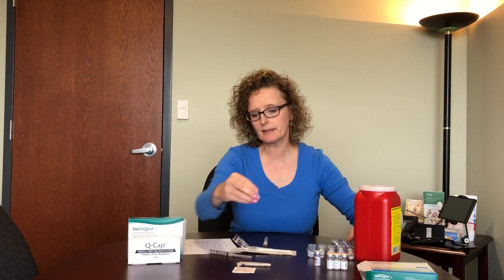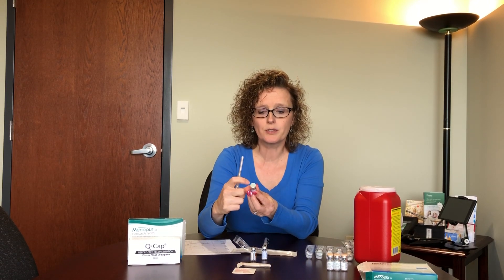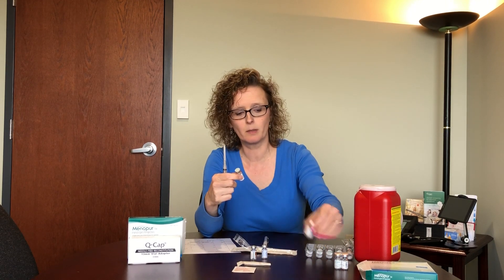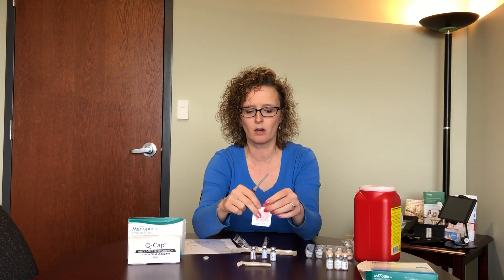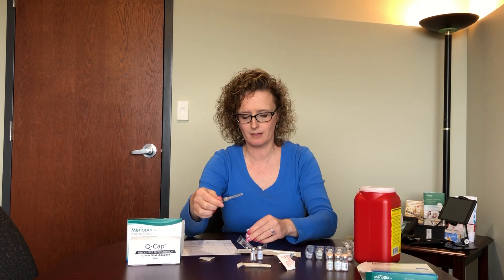Since we don't want to waste any medication, we're going to use plain empty vials of saline to show you how to mix. Our needle is sterile inside the cap, so we're not going to open that just yet. The saline has a gray cap and Menopur has a peach cap, so you'll always be able to tell the difference. These caps can just be popped off with your thumb or fingernail — whatever works easiest. Then take your alcohol swab and cleanse that gray piece to keep everything sterile.